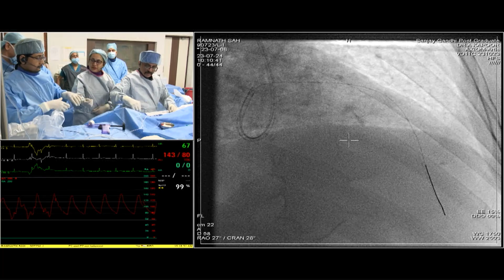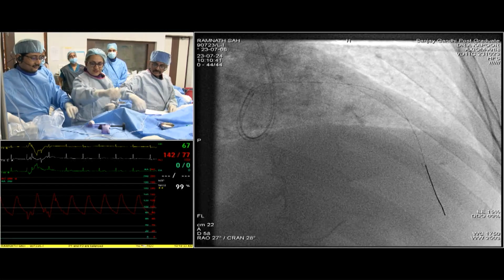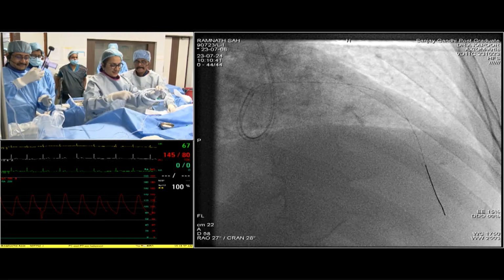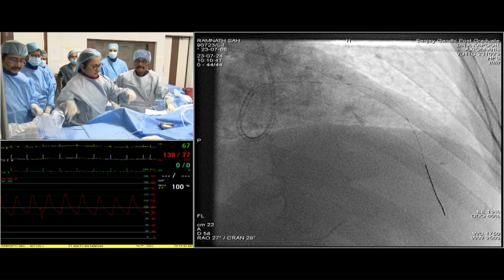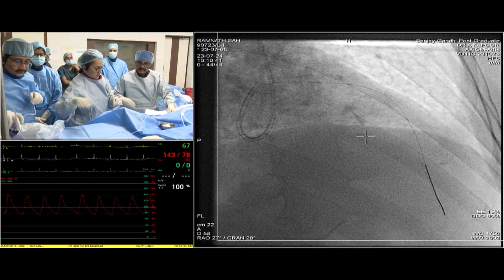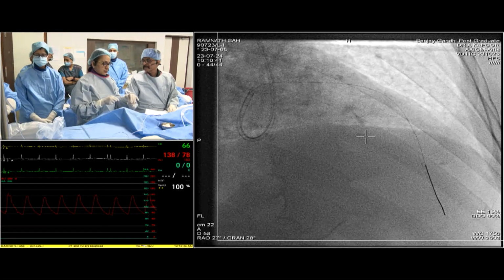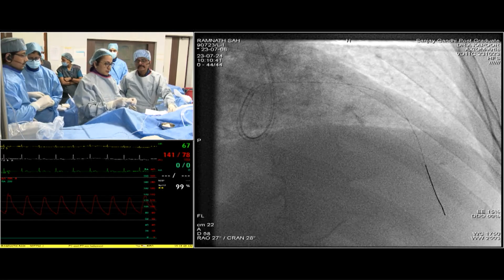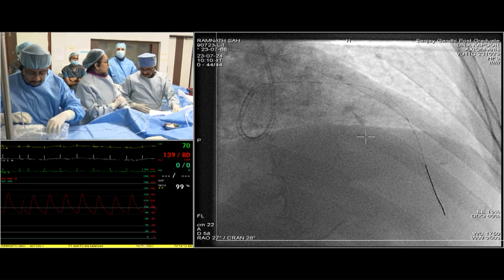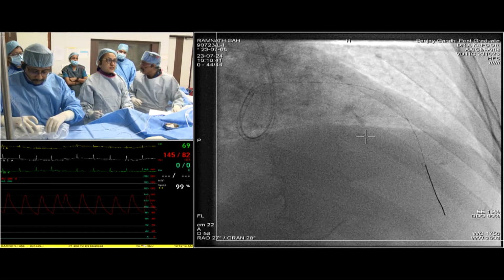So which imaging, Ankit, do you want to go ahead with, IVUS or OCT? Ideally, in these ACS cases I would like to go ahead with OCT, because plaque morphology is a prime concern: how to modify the plaque, and we are also suspecting thrombus. OCT probably gives a better picture. Sir, in an ACS, we have to look at the plaque morphology.